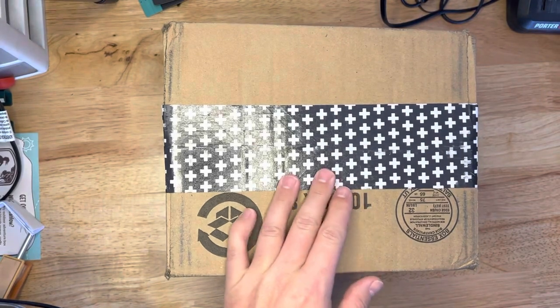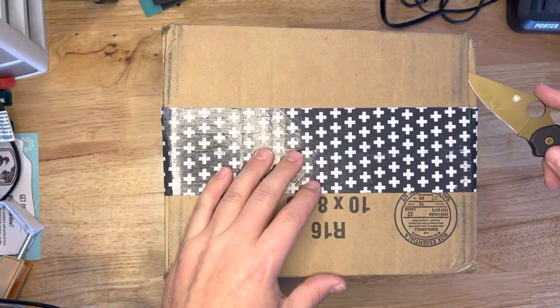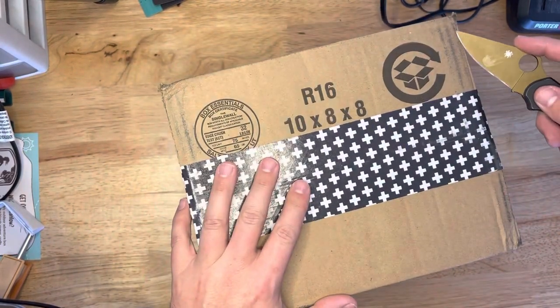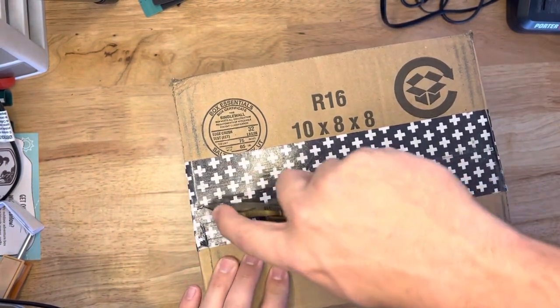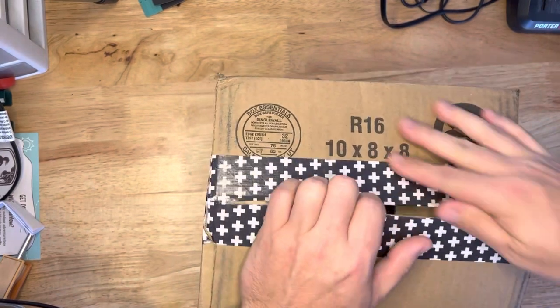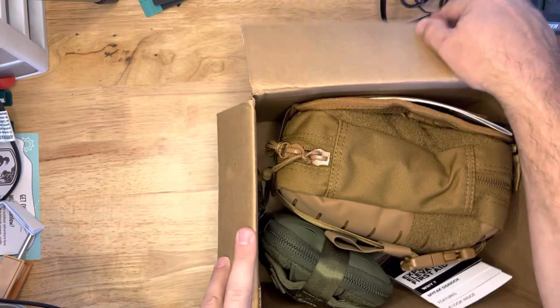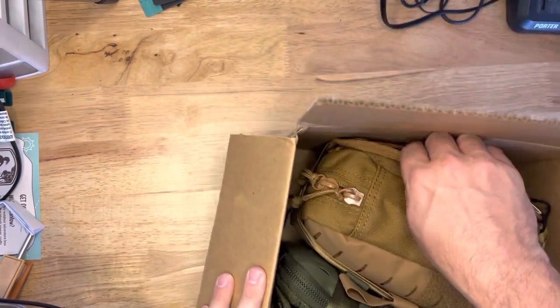All right, what's happening? We got an unboxing from MyMedic today. We've got a couple new med kits that they've just launched. These things came out a little bit ago, but there was a little bit of a supply chain issue, so these just got to me today. So let's check them out, shall we?